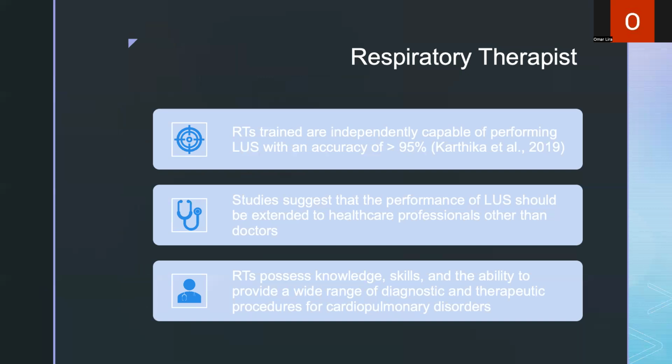Respiratory therapists can be trained, and studies have shown that RTs who are trained independently are capable of performing lung ultrasound with an accuracy of greater than 95%. Studies suggest that the performance of lung ultrasound should be extended to healthcare professionals other than doctors.